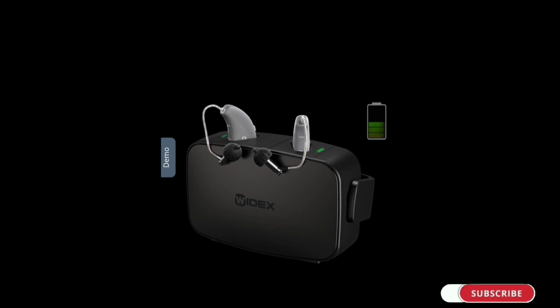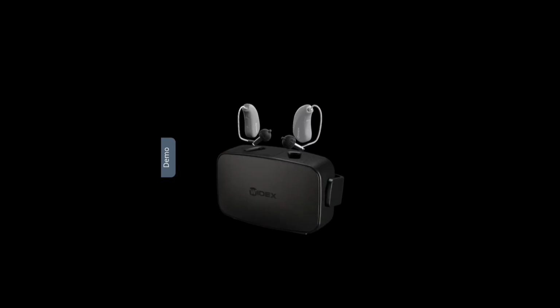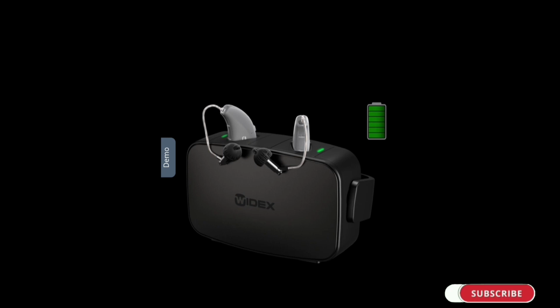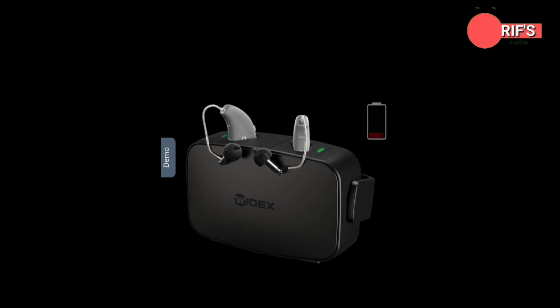Once you put the hearing aids into the charger in the respective position, each hearing aid has its own dedicated slot. The right hearing aid needs to be placed in the right slot and the left in the left slot, so that the LED indicator's light color indicates the charging percentage of the hearing aid. If it is red, it means the battery is below 20%, its battery is low. If it is orange, it means the battery is medium. If it is green, that means the hearing aid has more than 75% charge.